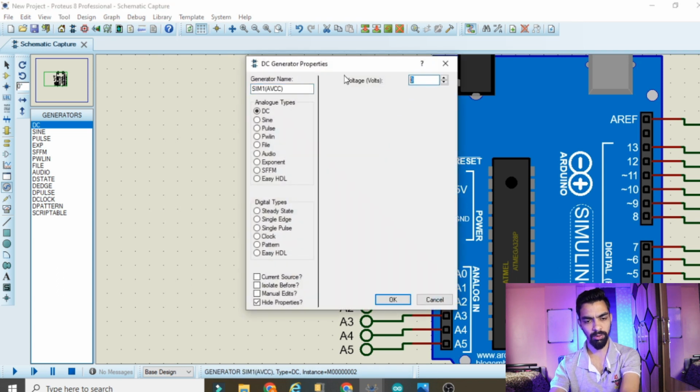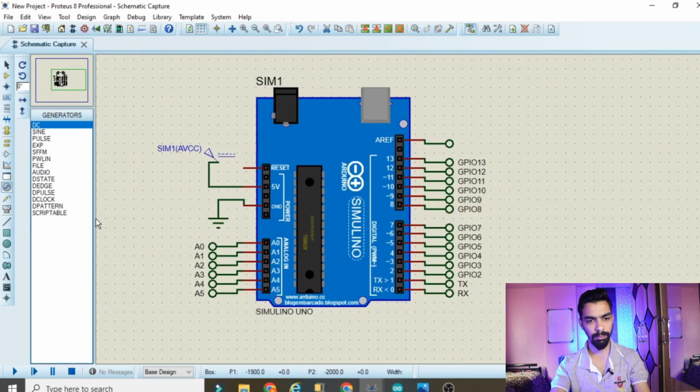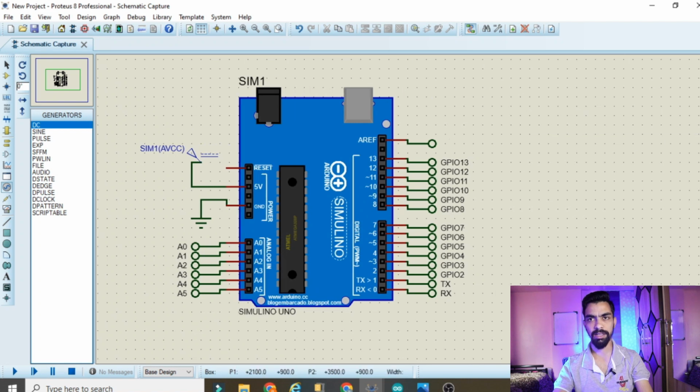Double click here and give your voltage 5. So in this way we complete the Arduino part. Now we will connect the LCD with the Arduino. So how to connect the LCD with the Arduino?